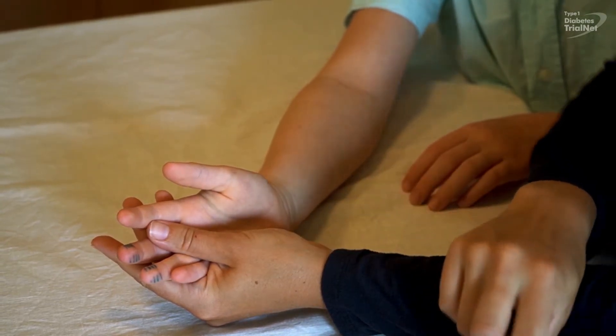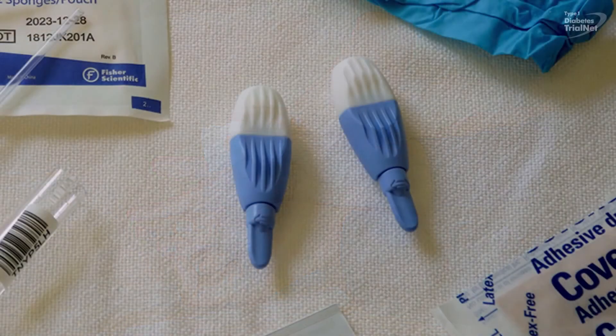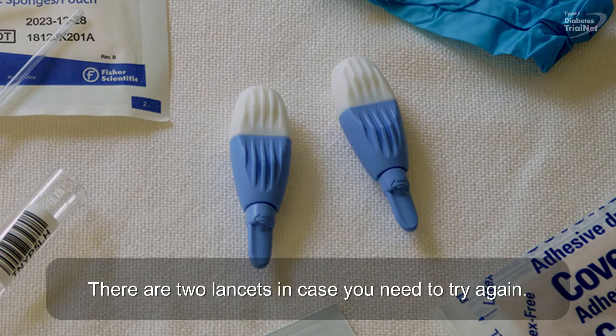After choosing a site, clean with an alcohol pad and allow to air dry. Use only the blue lancets from the kit. Do not use a glucose testing lancet, as it will not provide a large enough sample.